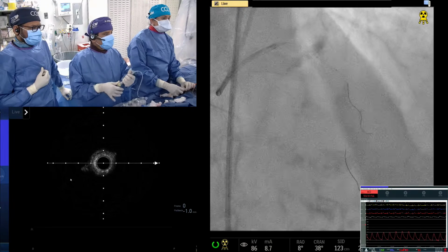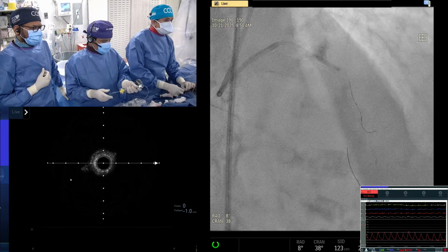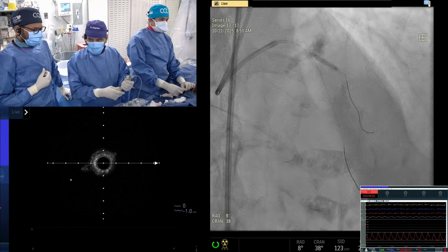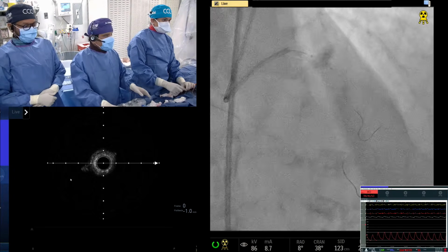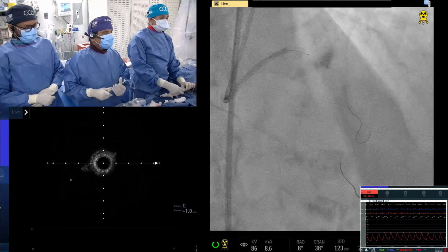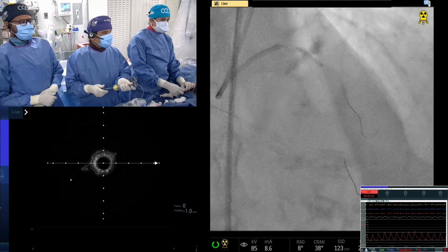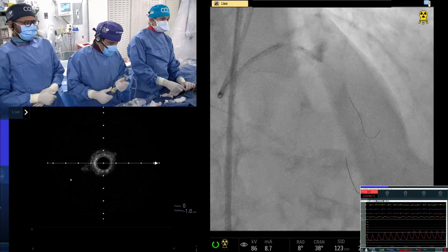It is okay. I have done dozens and dozens of bifurcation calcified cases. No two cases have been the same. Yeah, that is correct. There is always learning involved. Okay, now we can IVUS here. And right through this case, two of the world's best, most experienced operators continue to change the strategy. That's correct. Okay, down.